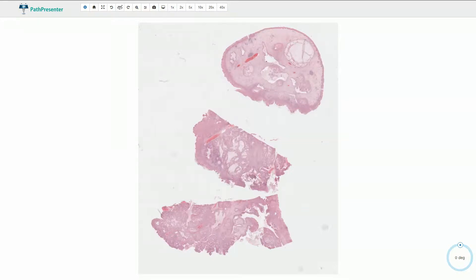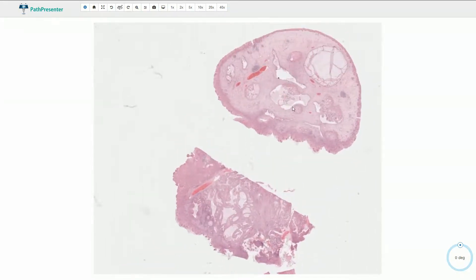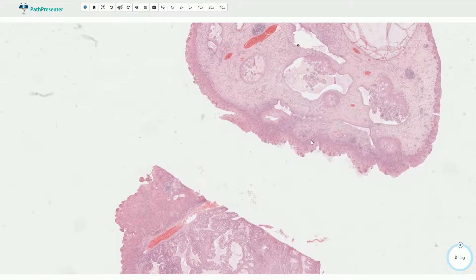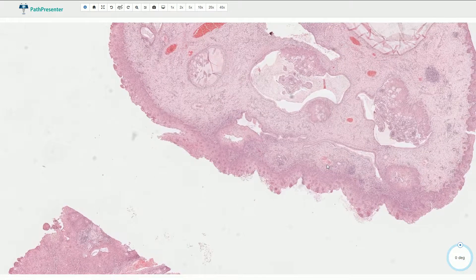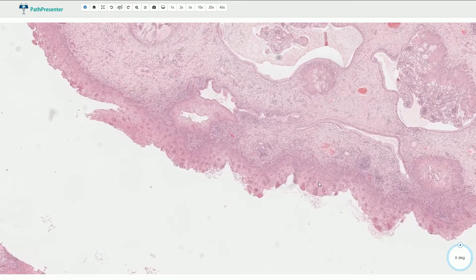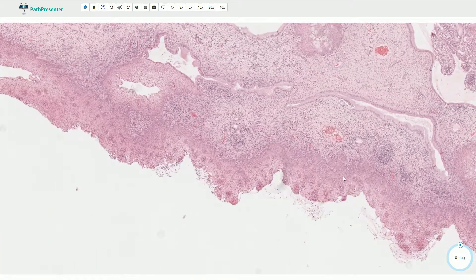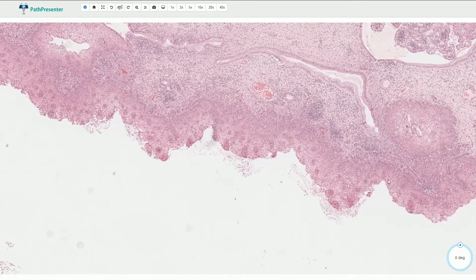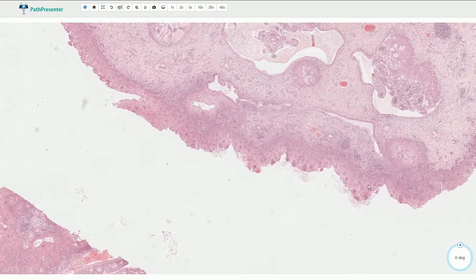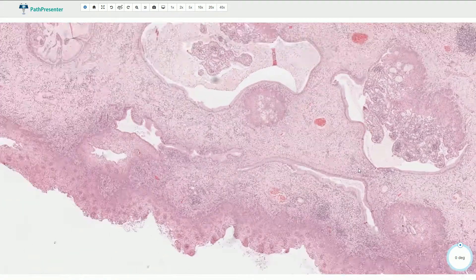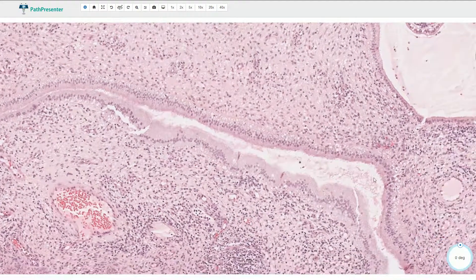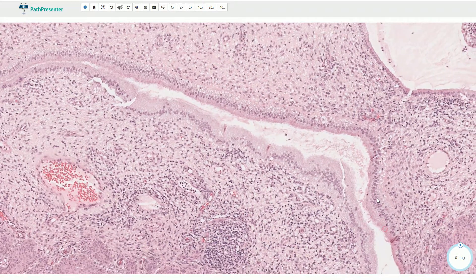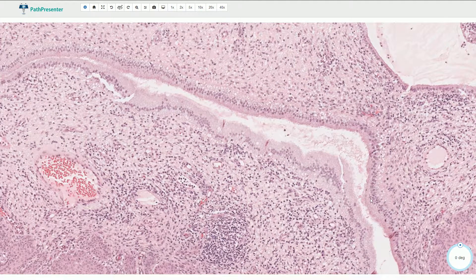Endocervical polyp is a benign polypoid lesion of the endocervix. It is composed of two components: an epithelial component and the stroma. The surface is usually covered by either non-keratinized stratified squamous epithelium or endocervical type of epithelium. It is usually associated with multiple endocervical glands lined by this bland, benign-looking endocervical type of epithelium with mucin vacuoles in the apical cytoplasm.